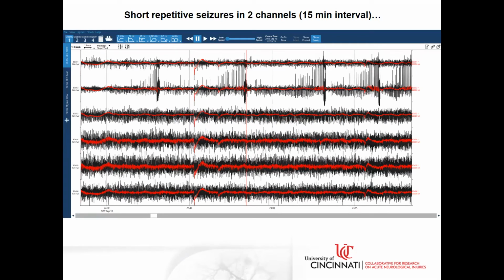And so I just want to share a few slides from this very interesting case to illustrate how all this fits together. The observation of seizures and spreading depolarizations and how they co-evolve in different patterns. And I want to do that using the Envision. This is the Envision software. No time to go through how to operate it and how to do all the settings, but you can see that the basic setup is the same here as on the bedside display on the Moberg monitor. The only difference here being that the white and black colors have been changed. So the white's in the background.